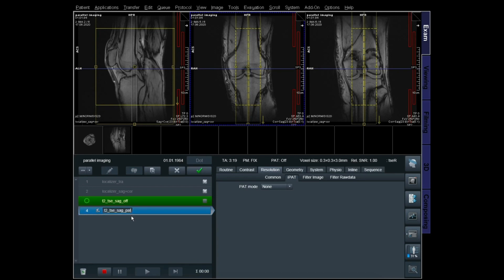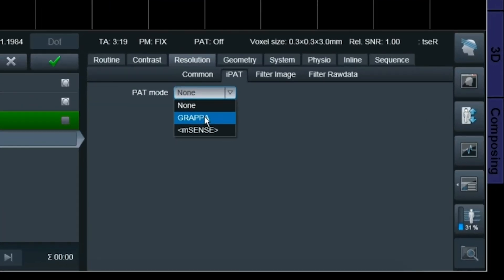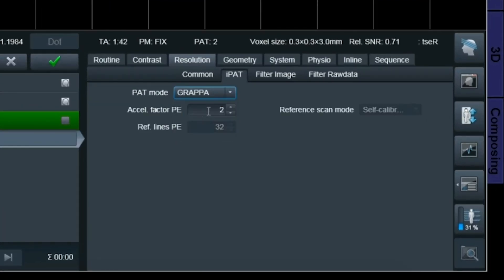My second scan has parallel imaging on at PAT2. In Siemens you use GRAPPA, which is one of the recommended parallel imaging techniques. The acceleration factor here is PAT2. To keep it simple: you have a K-space — let's say a matrix of 256, meaning 256 phase encoding directions. Without parallel imaging you sample the whole K-space, which takes time but gives good SNR. With PAT2, you jump over every second line, undersampling K-space to save scan time. But whenever you undersample, you lose SNR.